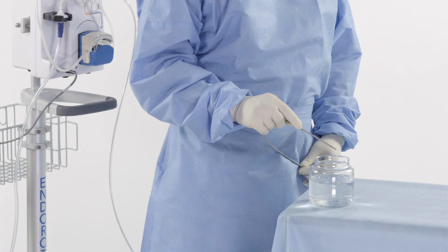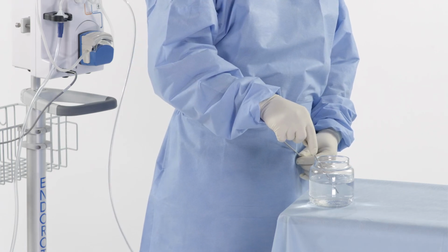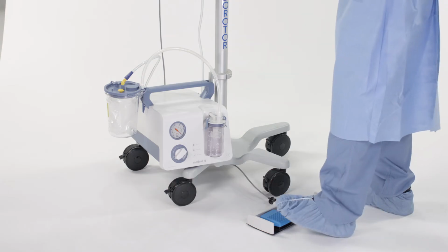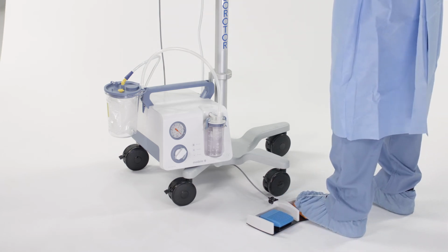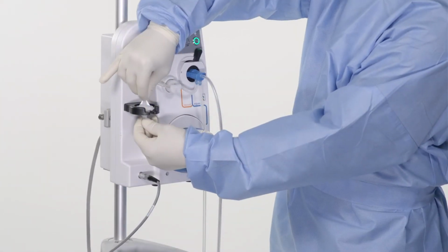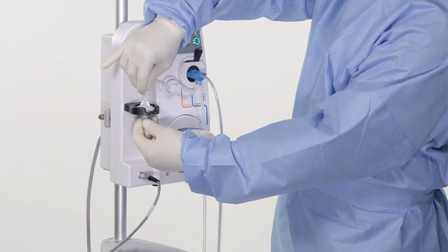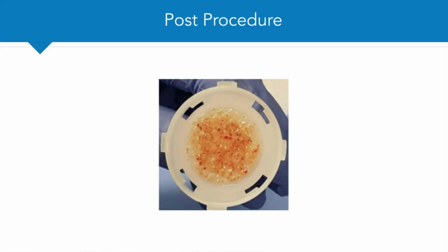After the procedure, with tissue collected in the specimen trap, ensure that there is no remaining tissue inside of the catheter. Place the catheter tip into a basin of water. Activate the blue pedal and press down on the orange pedal for 10 seconds until the line is clear of debris. Disconnect the vacuum tubing and ER short tubing from the tissue trap. Once specimen trap is disconnected, give the tissue trap a slight turn to remove the filter screen.